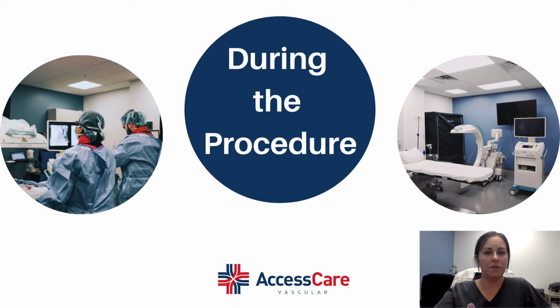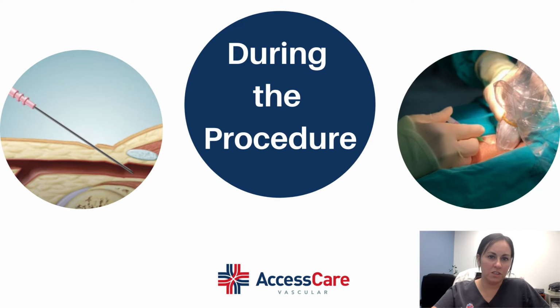Your vascular surgeon will then apply local anesthesia to your groin. You may feel a little pinch and burning sensation at first. However, the area will become numb and you just know we're working there. You shouldn't really feel any pain. Your vascular surgeon will then make a minimally invasive puncture in the groin with a needle to access your artery. They will access the artery on the leg that is not being treated.